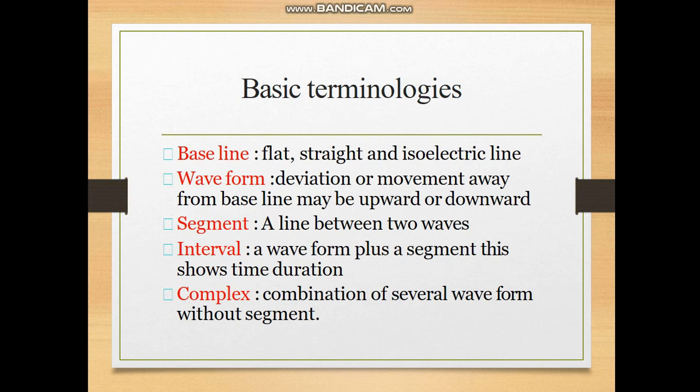Basic terminology: baseline, flat, straight, and isoelectric line. It is the baseline. Waveform, deviation or movement away from baseline, may be upward or downward. Segment, a line between two waves. Interval, a waveform plus a segment. This shows time duration. Complex, a combination of several waveforms without a segment.